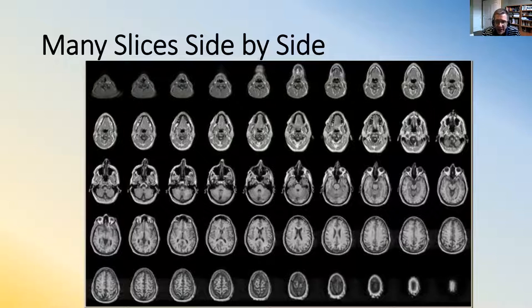Oh, on one particular slice, I think I see that, looking at a particular structure in there. And then they can tell, does it extend underneath the slice? Is it above the slice? How far left, right? Things like that. So really, looking at slices is generally the way things are done medically.